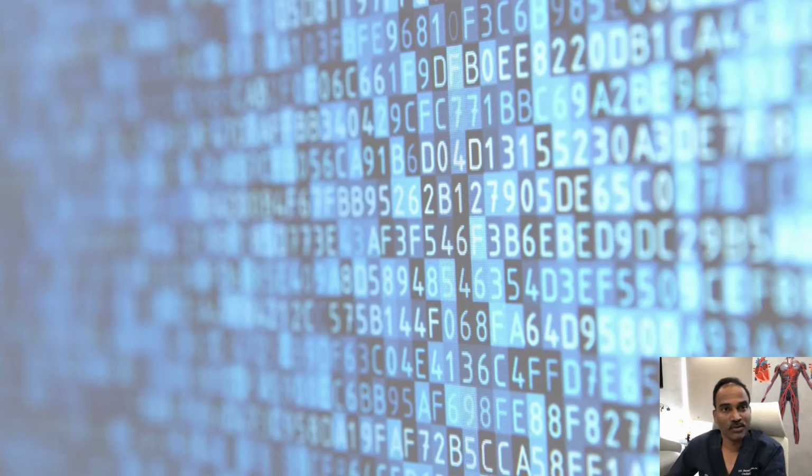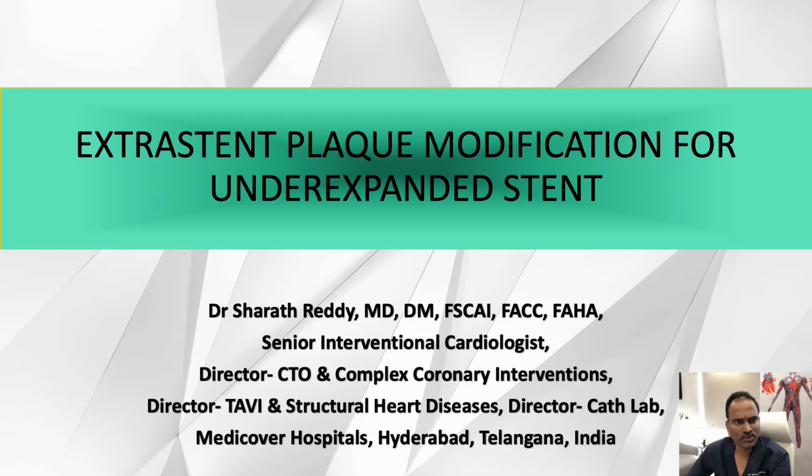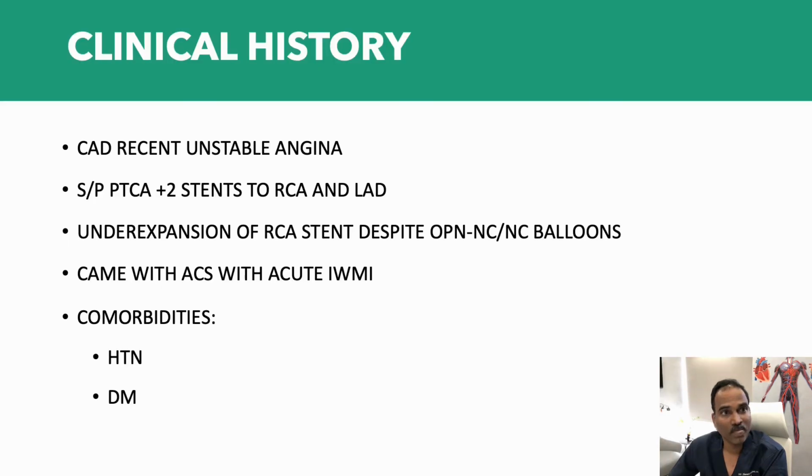Yeah, so welcome to Decoding Complex PCI case 18. Today I'm bringing one recent case of mine, in which we used one extrastent plaque modification technique to expand an unexpanded stent in the right coronary artery. I'm Dr. Sharath, Interventional Cardiologist, Medicover Hospitals, Hyderabad.